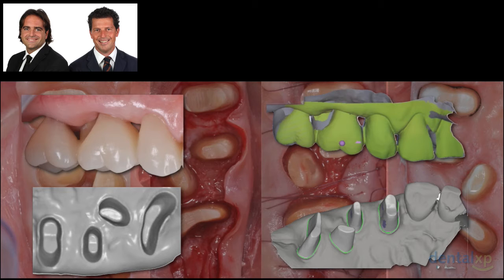And you can see here how the picture is very well defined, how we can customize the finishing line ourselves, since we are working with a vertical finishing line, so it's important to define it and do the digital ditching that the software permits us to do.